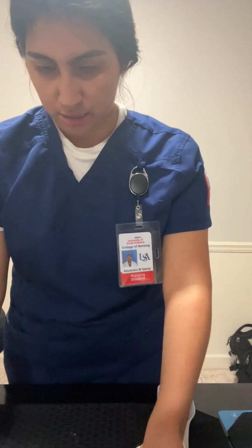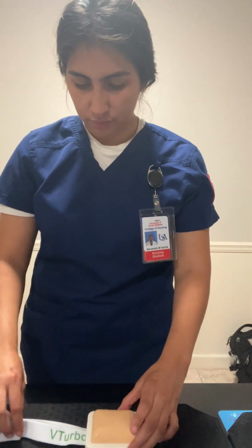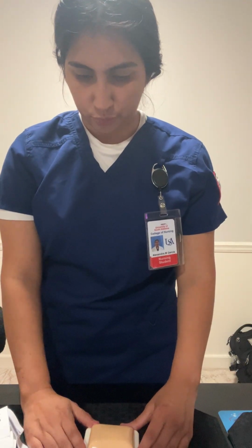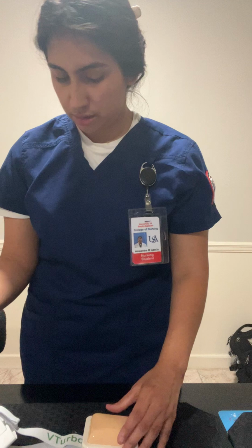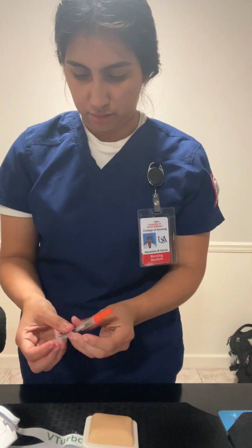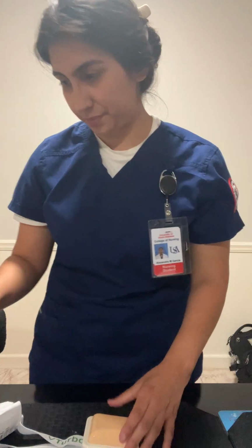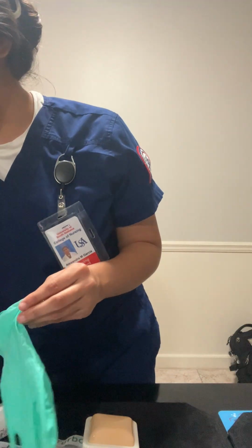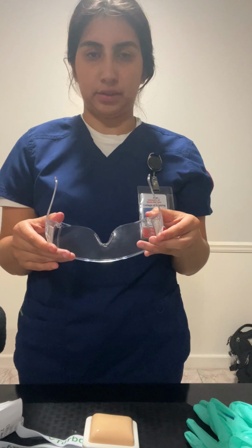And now I'm going to pinch. Actually, sorry, before that, I'm going to put on my gloves and my goggles.